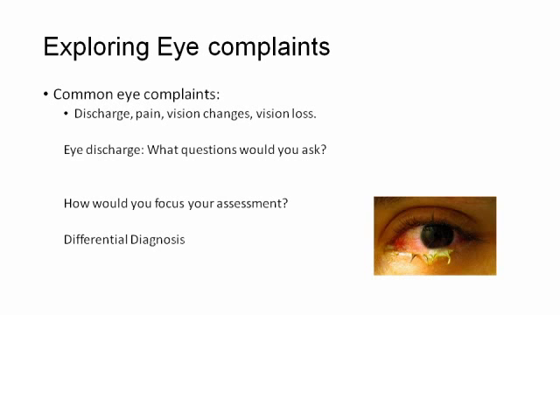Flash burn patients. Use it often in the ER. Need to dye and look at the eye through the lamp. Okay. Yeah. And again, that's not something that I would do. I work in the primary care office, so that's not something that I would do in the office. Like I said, I would send that to an eye doctor and have them do it. But in the hospital and the ER, they can do it very easily there.